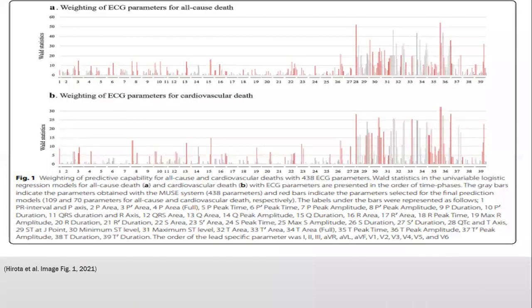So all this wonderful information leads us to our focus today of a study involving a 12-lead electrocardiography, which is widely used for detection of cardiac disease. Electrocardiogram readings have been reported to be affected by aging and therefore can predict patient mortality. That means that age will show different types of heart patterns.